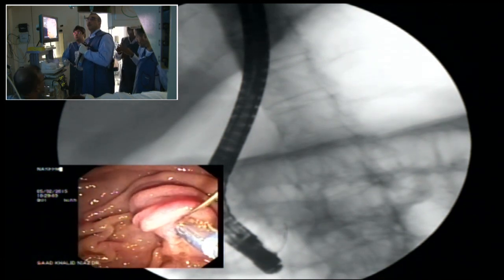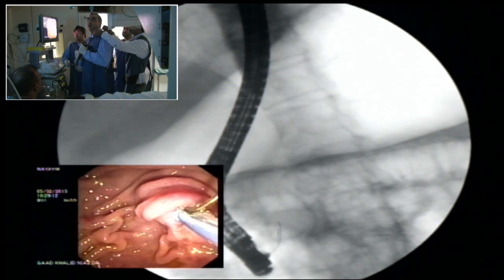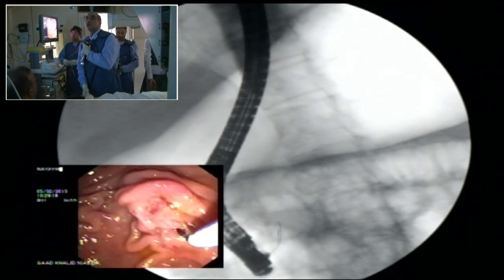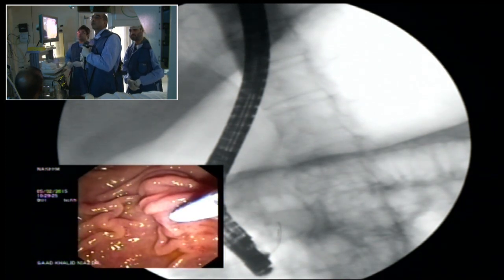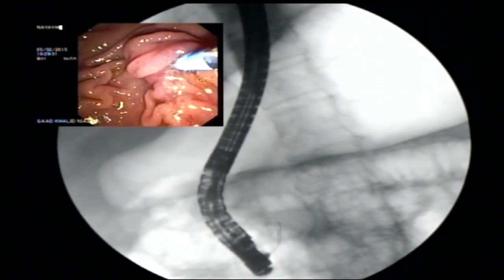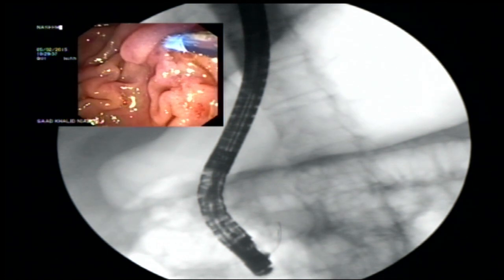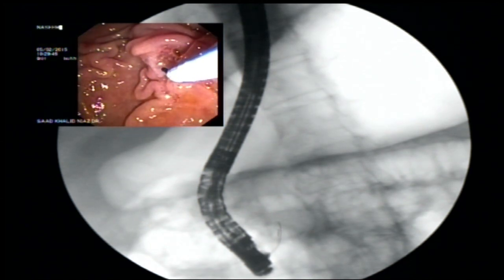Pull the spindle and pull towards you. So that will straighten the papilla. Okay. एक ख्याल, आराम से. Relax the bow. Yeah, you have to engage it, ठीक है, and then go and you pull the spindle towards out. What that's going to do is straighten the papilla and get it lined up. बो करें थोड़ा इधर. So what that does is when you go in, the direction of the spindle goes this way, and when you pull it out, it withdraws everything this way and aligns it in line.